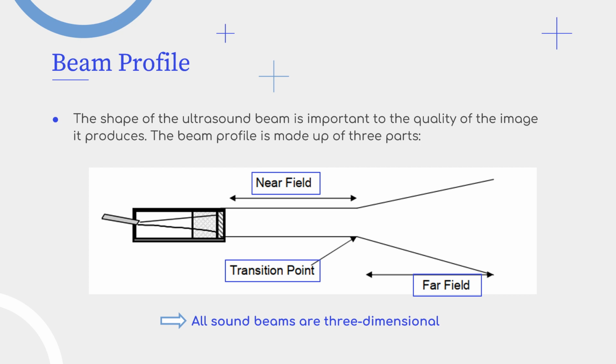The near field is the part of the beam useful for imaging purposes. However, this can be quite large in area, depending on the diameter of the crystal. Imaging requires a very narrow beam to produce high-resolution diagnosis.